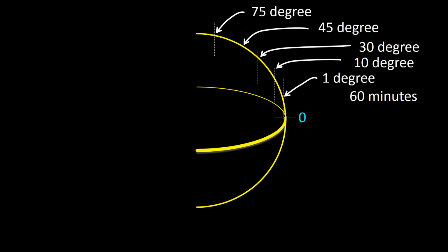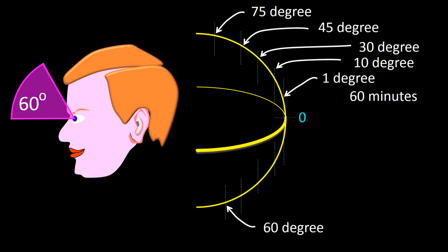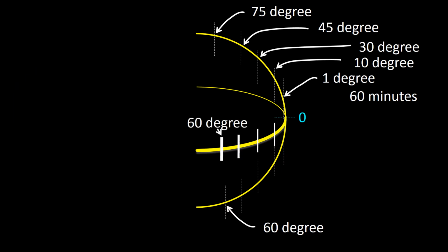I am going to do the same thing in the lower retinal segment. Notice that the furthest point from the fovea with visual field elements is 60 degrees, which corresponds to the 60 degree of extension in the upper visual field. As you can see in this frame, I have added lines in the perpendicular axis corresponding to the temporal retina.